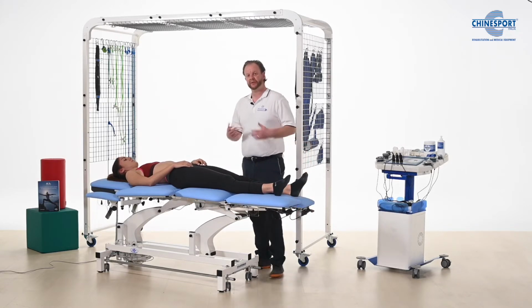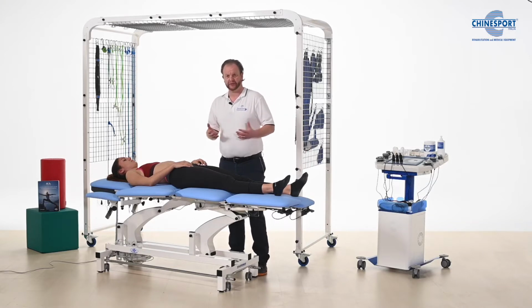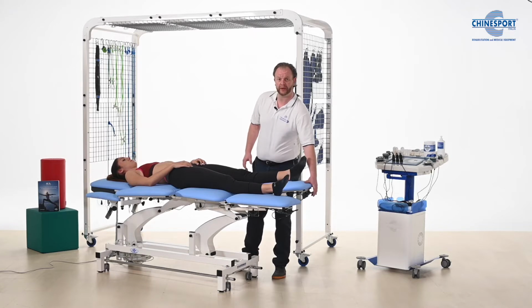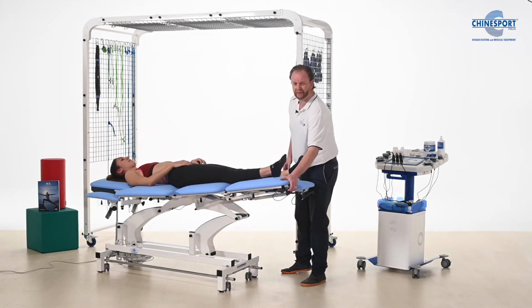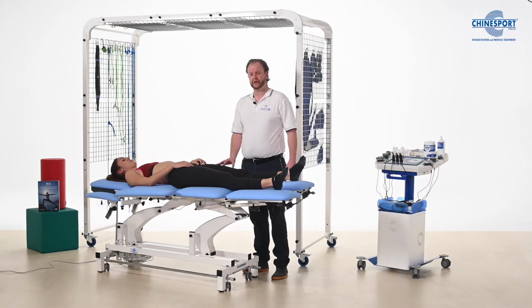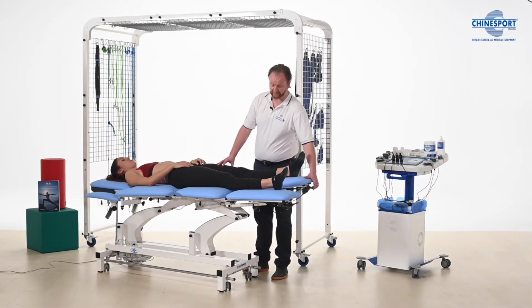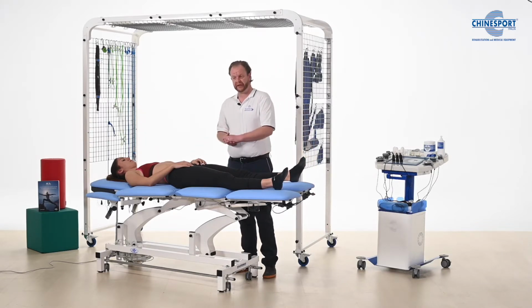Another stretch that we frequently do with back pain patients is the hamstrings. As you know, the hamstrings are also often connected, especially when we're talking about chronic back pain. In fact, before we go to the hamstrings, we may want to talk about people who have segmental pain and they have pins and needles down the leg because of an impingement or because of sciatic pain.